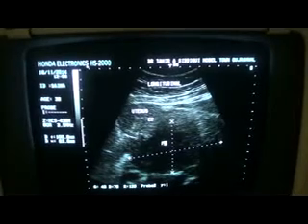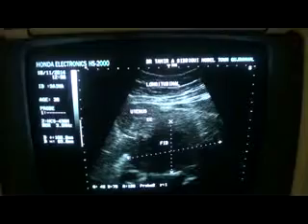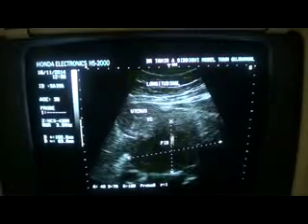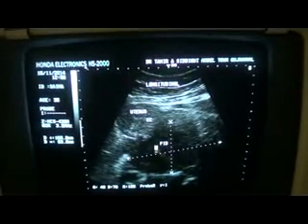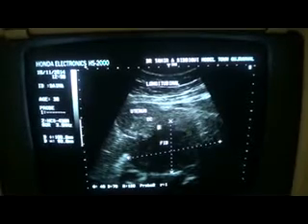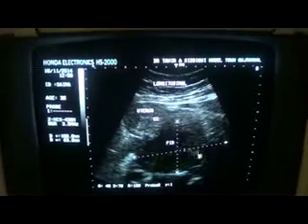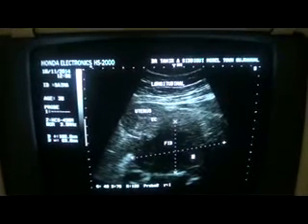So this is again a fibroid relating to the posterior wall, it is pedunculated, and you see, this part is intrauterine. This is the pedunculated part, which is extending posterior and inferiorly.